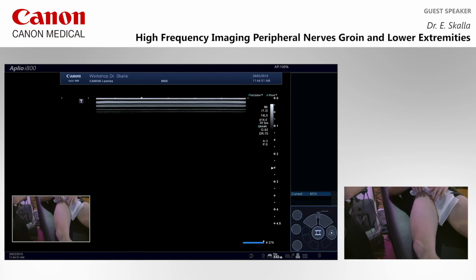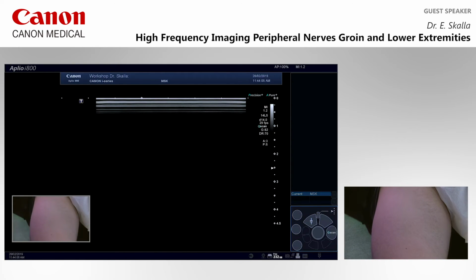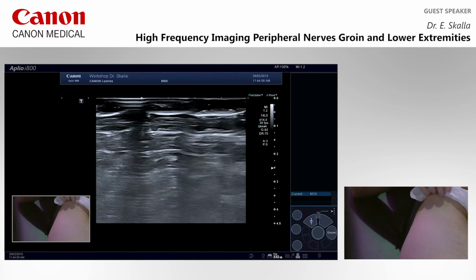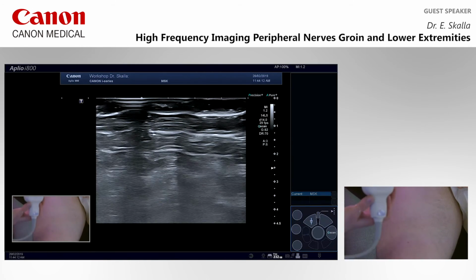So we will see the big nerves first. Femoral nerve. So what's our external landmark? I think we've heard it a lot of times now. What would you search?